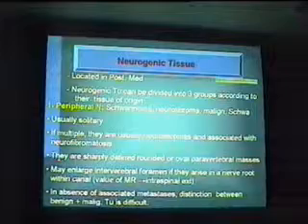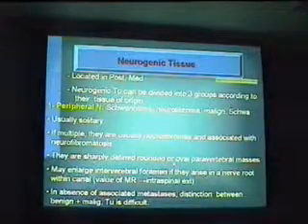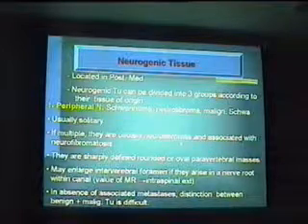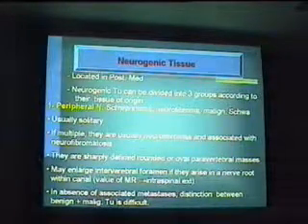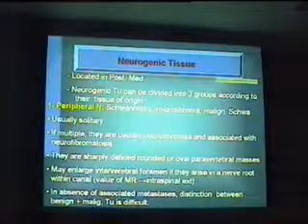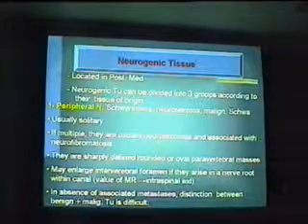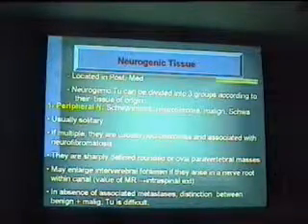أوكي؟ They are sharply defined, rounded or oval paravertebral masses. عادة دائما لهم علاقة بالvertebral spine. وبيعملوا لي sometimes ألاقيه بيعملوا لي scalloping وenlargement of the intervertebral foramen because of the origin of the nerve root.